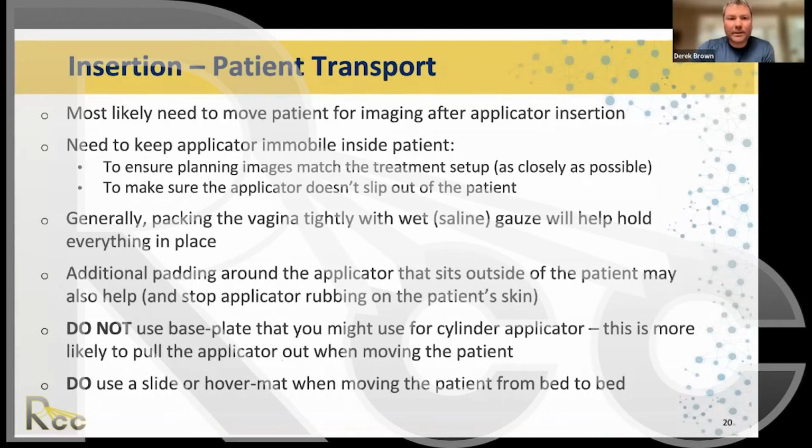You can also get something almost like a hovercraft transfer bed. The patient is always lying on this mat throughout the entire procedure, and you plug it into something that blows air and puffs it up. Then you can shift them very easily from one bed to another without having to move them or pull them on a sheet. There are lots of things like that. It's described here, a hover mat.